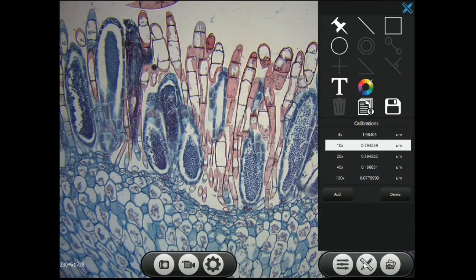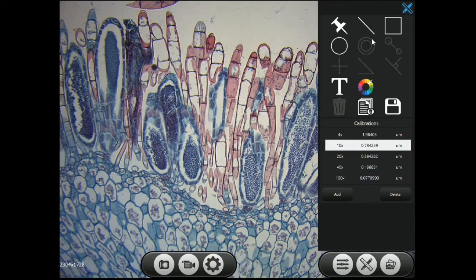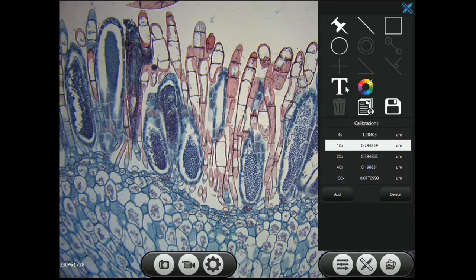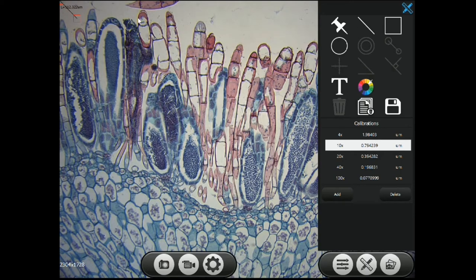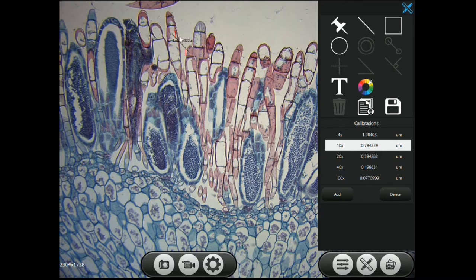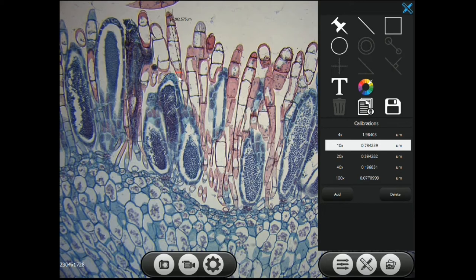Click on annotating, click on the icon of the ruler and pencil. There are three common annotations: the line, the pin, and the option to add text to your photos. To add a line, click the line button. It will appear in the top left. Move it to where you would like it to be positioned on screen and click the boxes at each end to adjust the length.